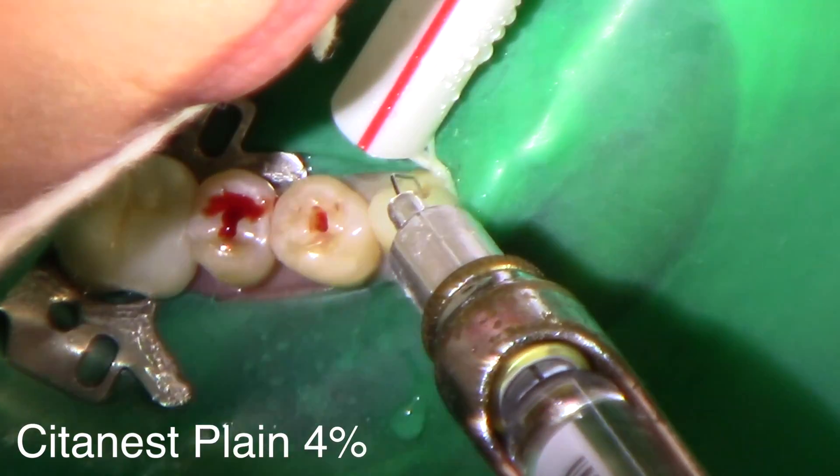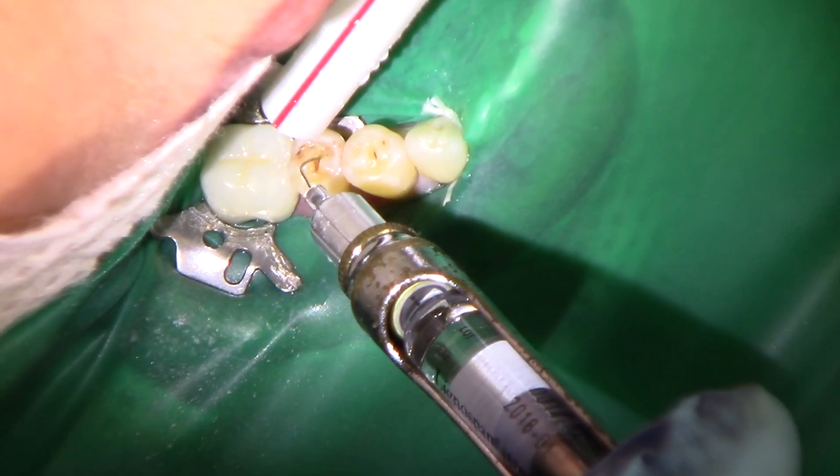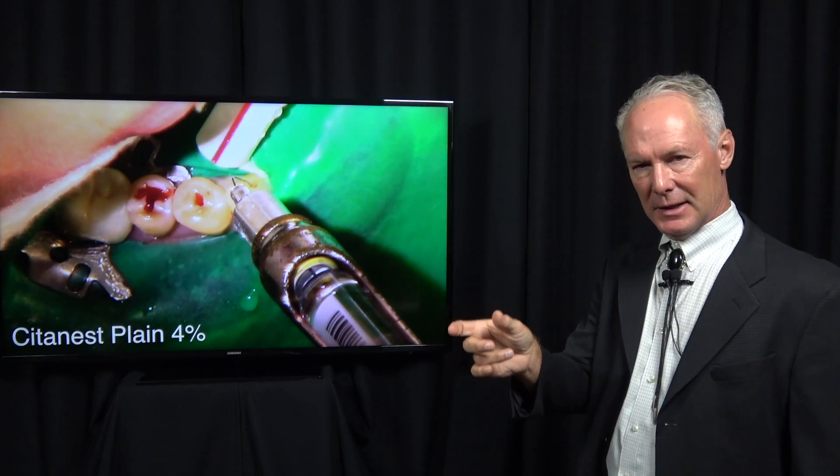You can see how hyperemic these teeth are. The blood is just pulsing out of the pulp chamber. Once I've entered the pulp chamber, come back with your syringe and very lightly anesthetize into the pulp chamber.